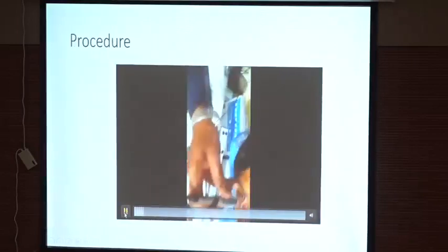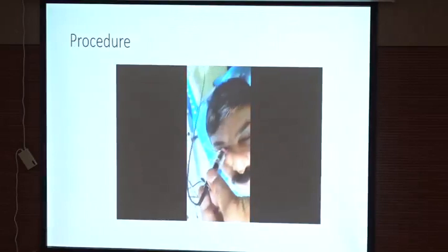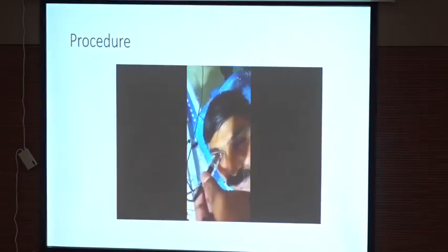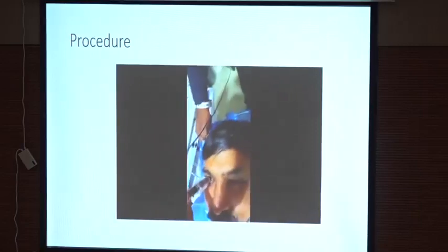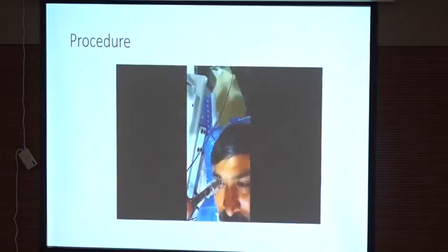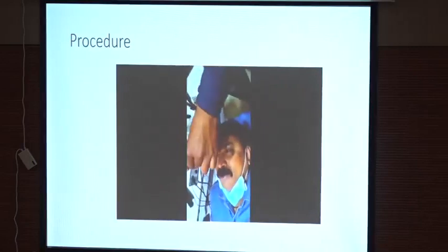The patient is made to lie supine. The cornea is anesthetized with Paracaine. Then the fluid is injected and a water bath is created. And once that is done, the readings are taken.